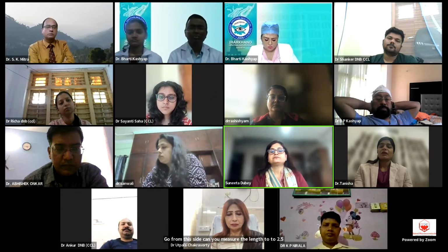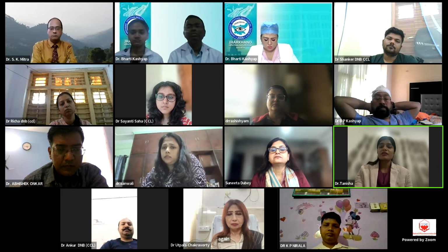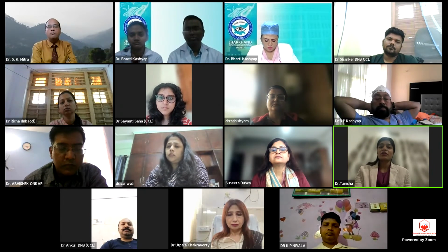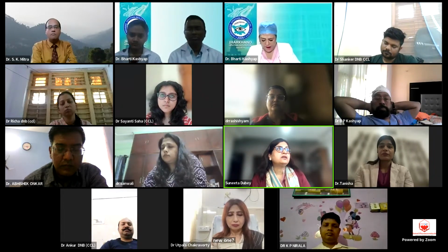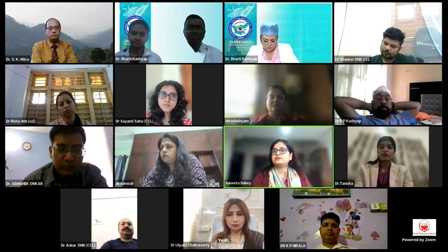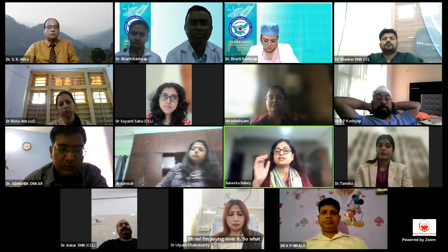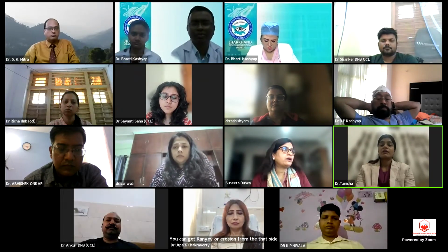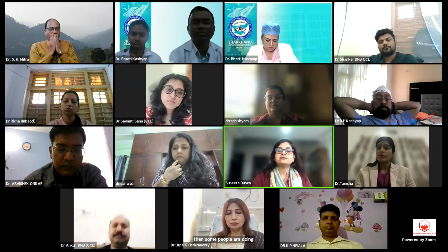Ma'am, what is your take on the tube extenders that are available? Like in the previous surgery, you showed that the tube was very short, so you used a new implant. Yeah, they are available, but the tube extenders have that very hefty thing over it. So over a period of time, you can get conjunctival erosion from that side.